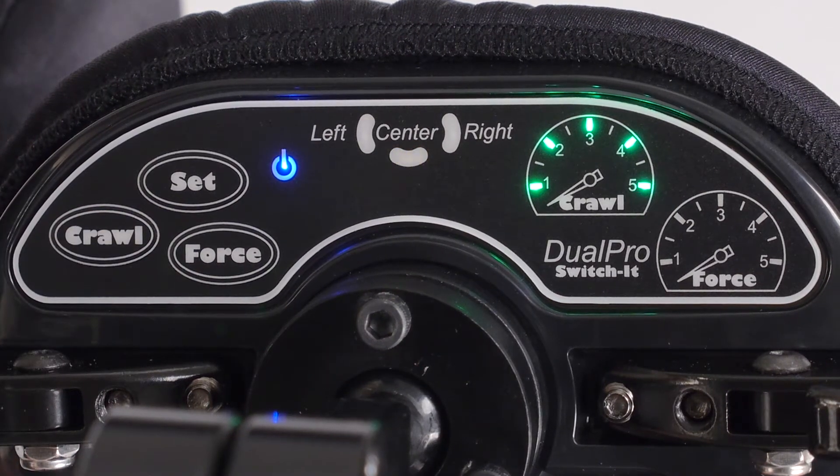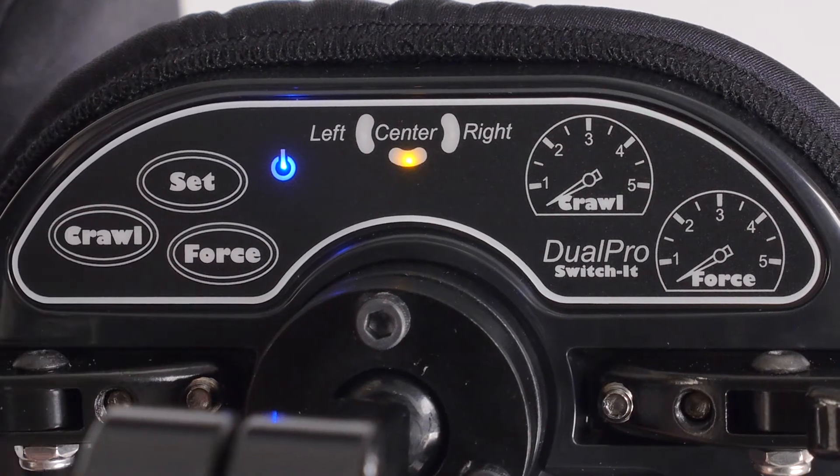Assuming the chair is programmed to run at 100% speed. If the Crawl button is pressed after all five lights are lit, the indicator cycles back to zero.